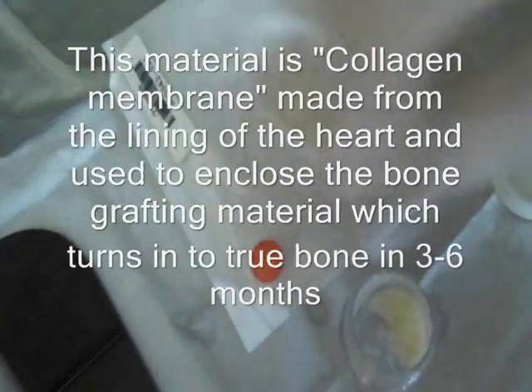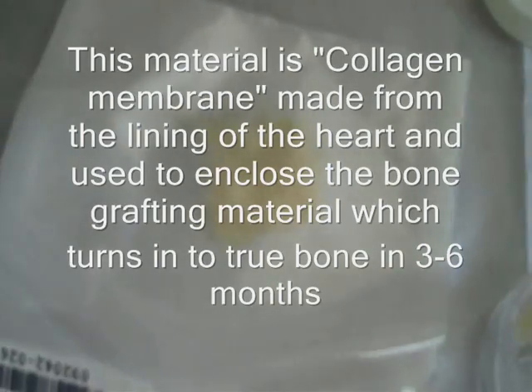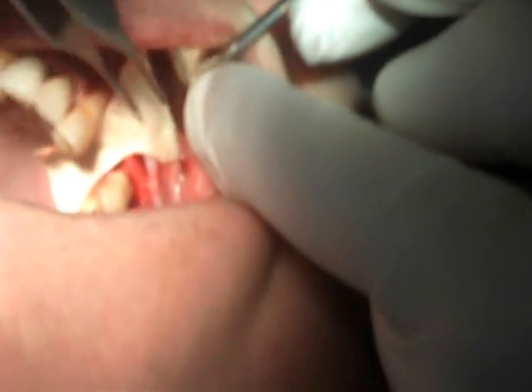It's actually made of pericardial tissue. It's got great handling ability and it really conforms nicely to the area. I'll cut it and trim it to size. The purpose is to help stabilize the graft and allow for proper healing. First I'm going to actually measure it, make sure it fits, and trim it in the area here. Once it's trimmed, I'll position it and then place the graft. Once the graft is in, I'll just wrap it around the graft material. Once again, it's a pericardial tissue. I trim the membrane to an appropriate size.